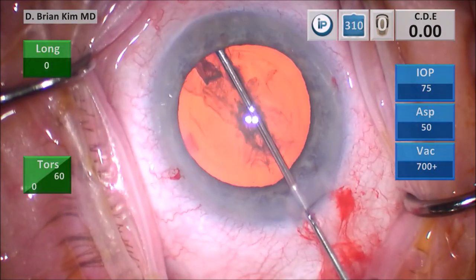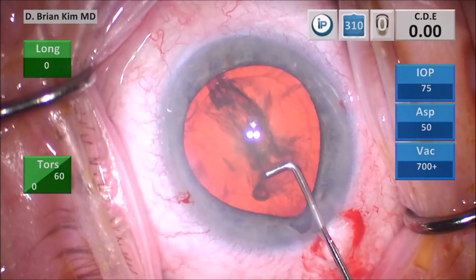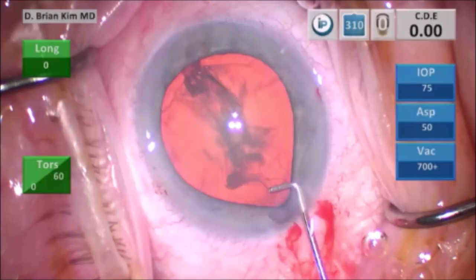I perform my standard capsular fornix hydrodissection technique, and as I finish the wave and I'm about to burp the wound, I see that there is significant peaking to the wound now.